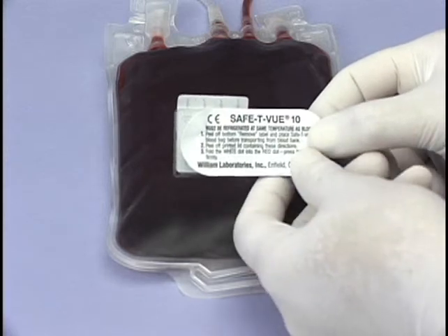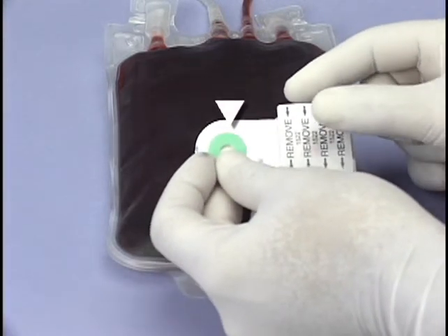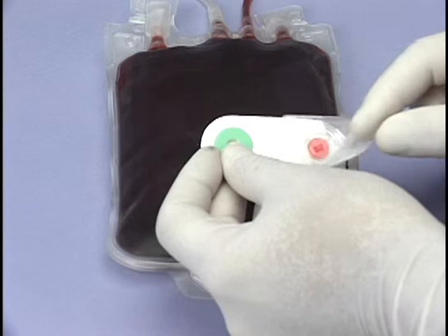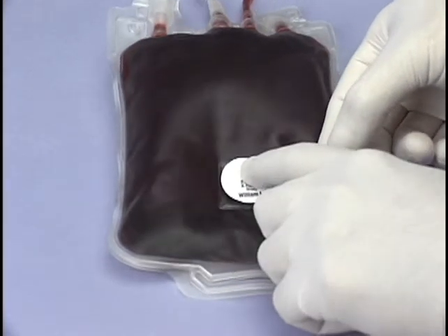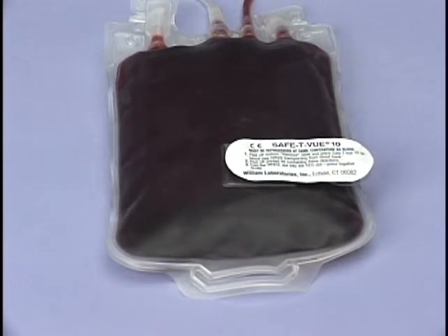Take great care to handle the Safety View indicator by the color-coded end only. Peel off the white remove label and attach the Safety View directly to the blood bag where there is the greatest volume of blood. This is usually on the back and near the bottom third of the bag.